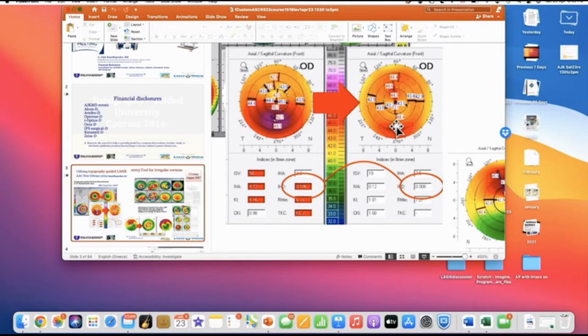Positive is a good point. How about if I told you that the axial length is 24? Will that help? Axial length 24. Keratometry here is an average 44, 42, 43. So it should be plano, maybe a little bit more because keratoconic eyes have a deeper chamber. So your cornea is sitting a little bit forward. It's more, and this is the anterior cornea surface. So the back cornea surface has a high negative power. So the keratometry should be in total of about 42.